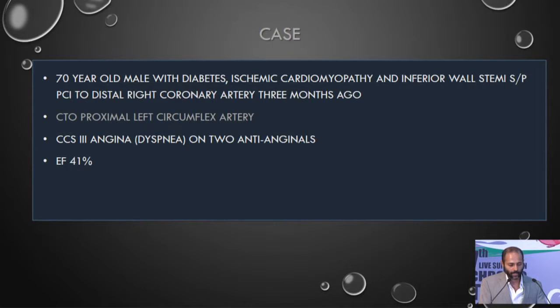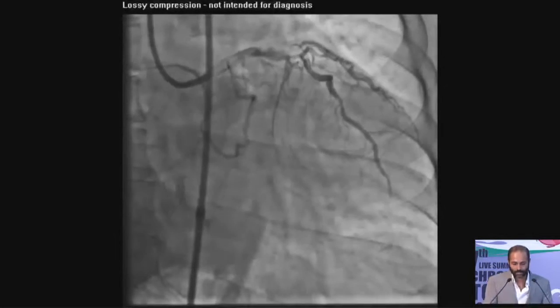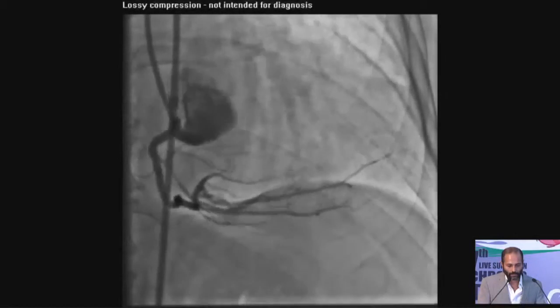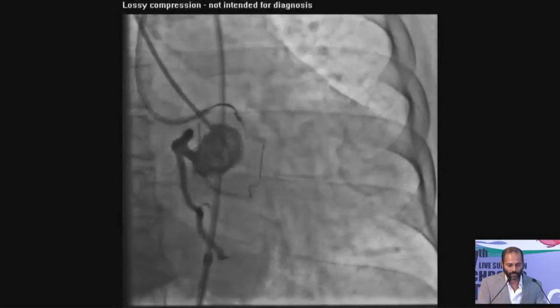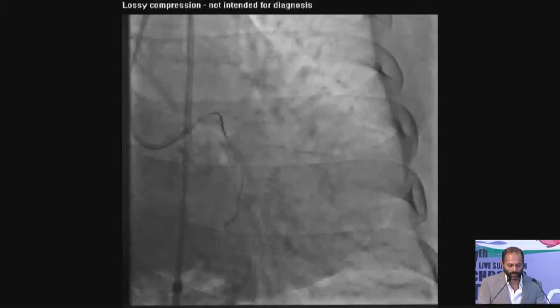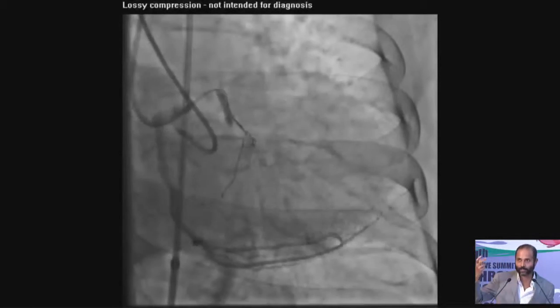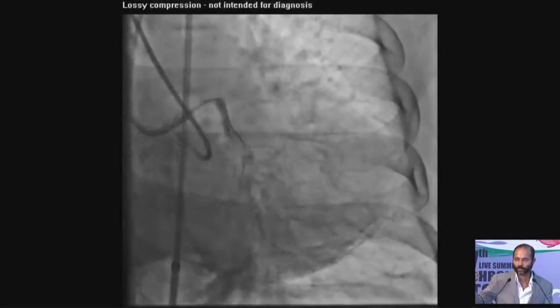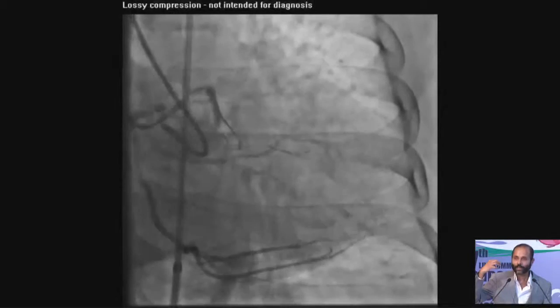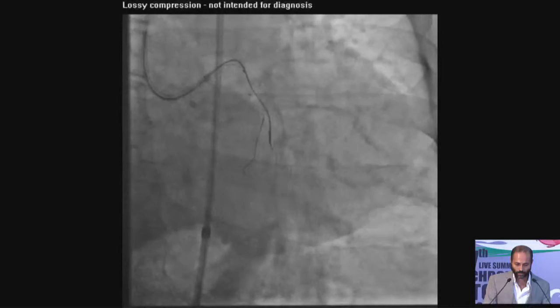So again, this is a patient with a CTO of the circ. The case details actually don't matter particularly, but that's the circ. That's the right. So not great retrograde options. So the initial attempt was an IVUS guided puncture, and then you essentially are doing what, one of the things that was not talked about, I think, was BASE, where you create a dissection just proximal to the CTO proximal cap with a 1-to-1 NC balloon, take a microcatheter, take a knuckle, get into the subintimal space, and then push it really hard.